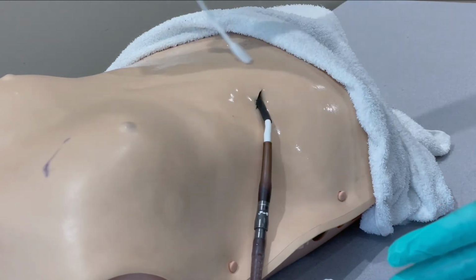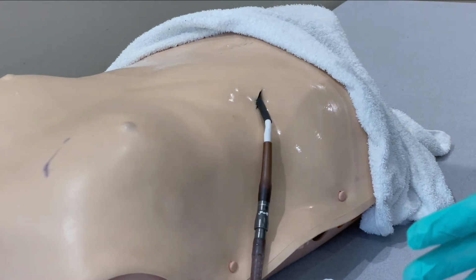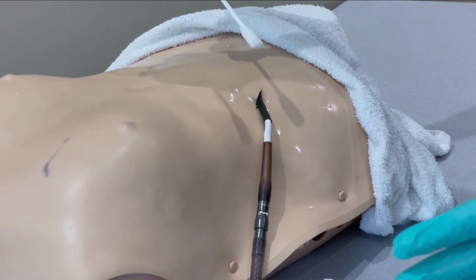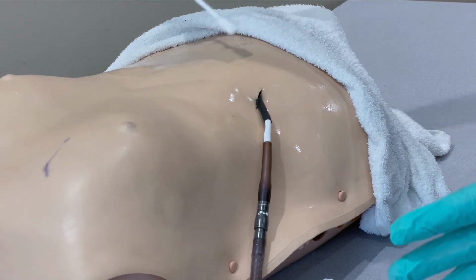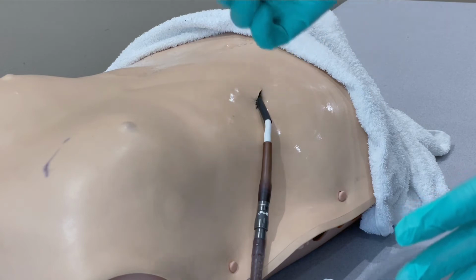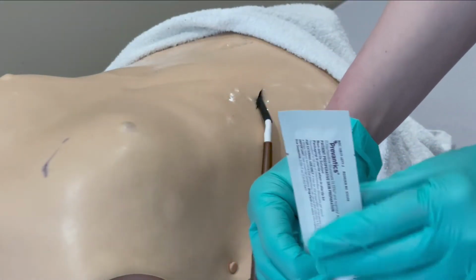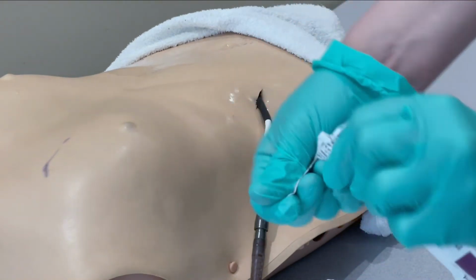Always while keeping your hands in view. Now that you have a nice wet surface area, we don't want to take this and go back into the middle and clean it, because you're going to take all of these germs that we collected and put them right into the middle. So now you're done with this lollipop, just toss it away. We're now going to take our second lollipop and do it again.